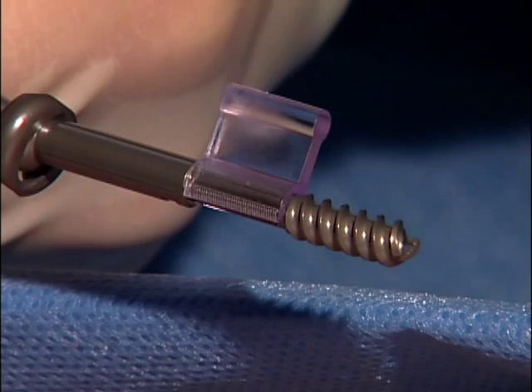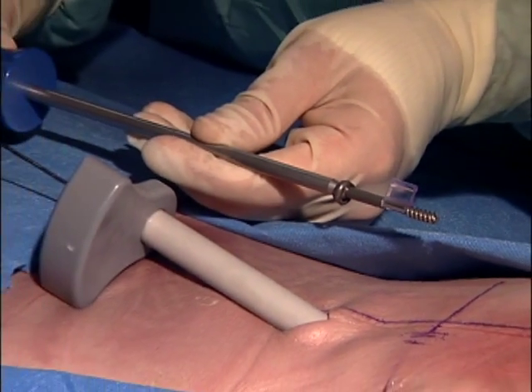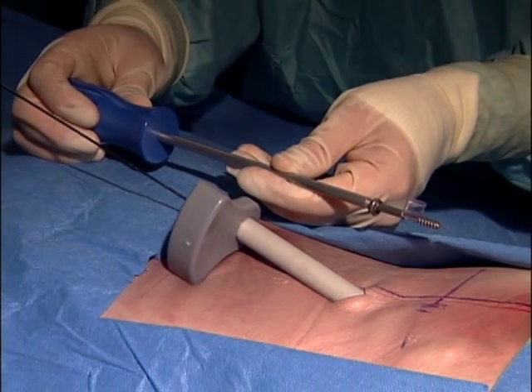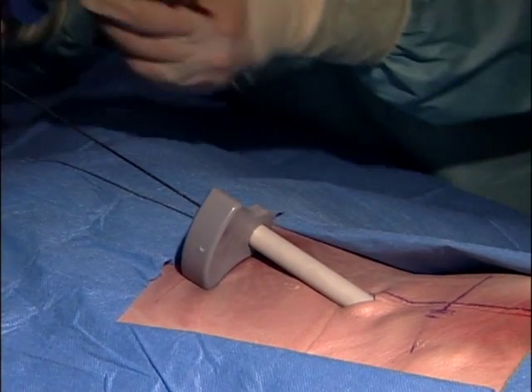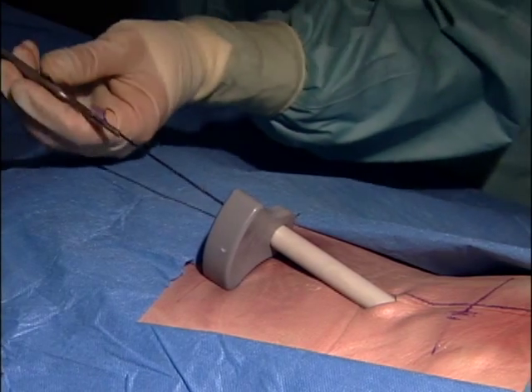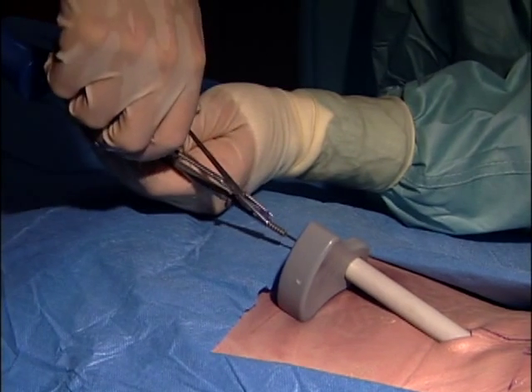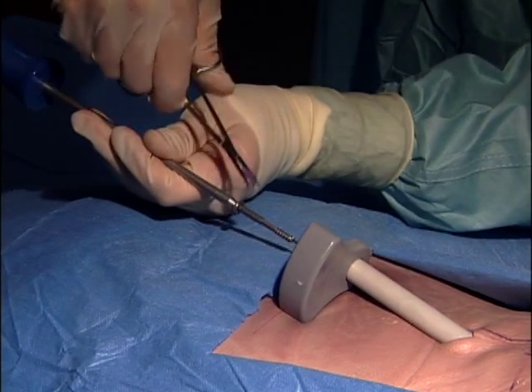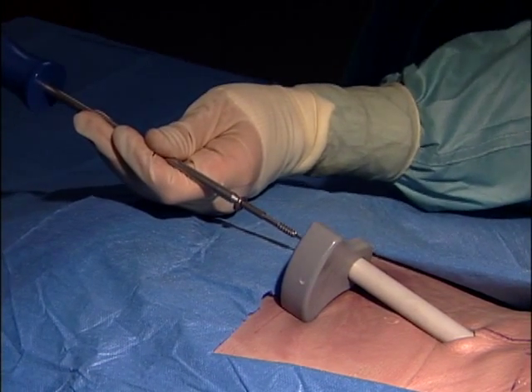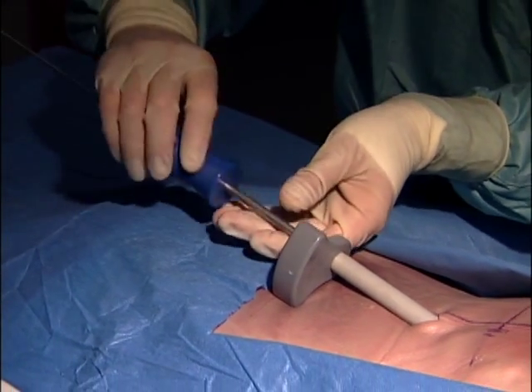The 4.5 mm bone lock PLS implant is loaded onto the driver, and care is taken not to remove the plastic clip until the implant is placed over the K-wire. Once the implant is over the K-wire, the anti-compression clip is then removed, either by hand or using forceps. And the device is advanced to and then into the bone.